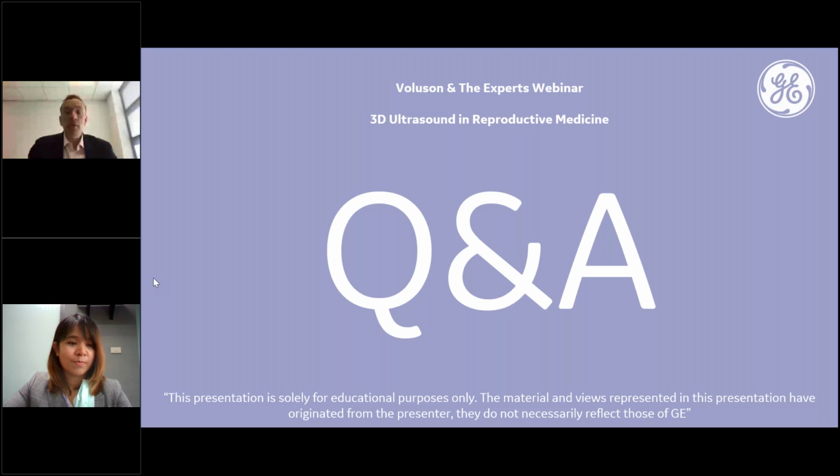My personal view on that one, Mario, would be if you've got lots of fibroids, I think that it's probably to some degree meaningless whether some are submucosal, they're going to be everywhere, aren't they? I think women with multifibroid uteruses, they're the ones who are much more likely to have a problem. And I think that's where myomectomy, potential embolization, but myomectomy has a significant role. I don't think measuring every single fibroid and trying to quantify them is helpful. I'm not sure it's even practical.